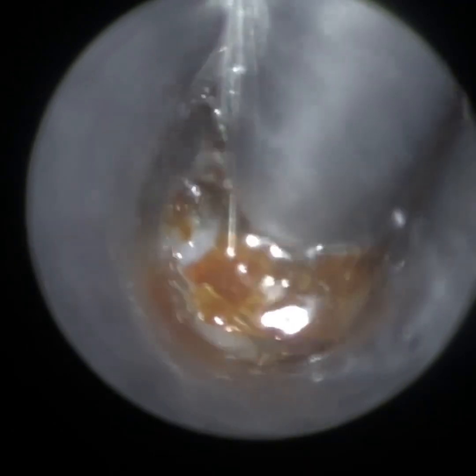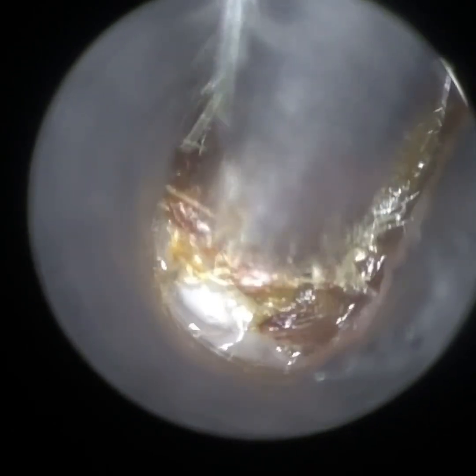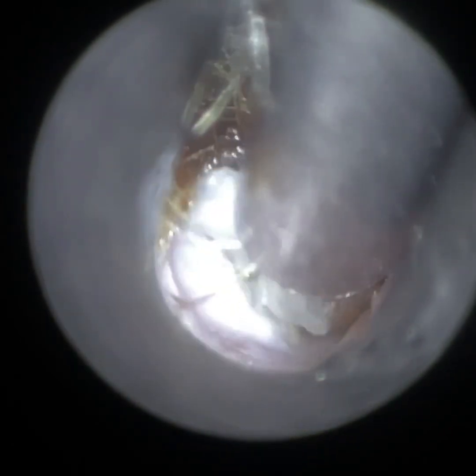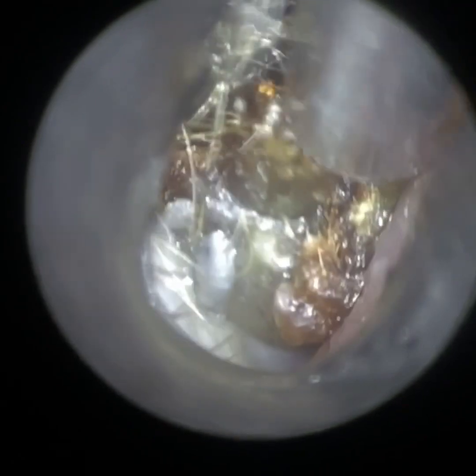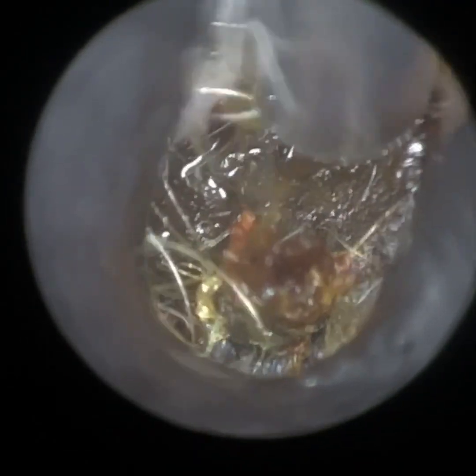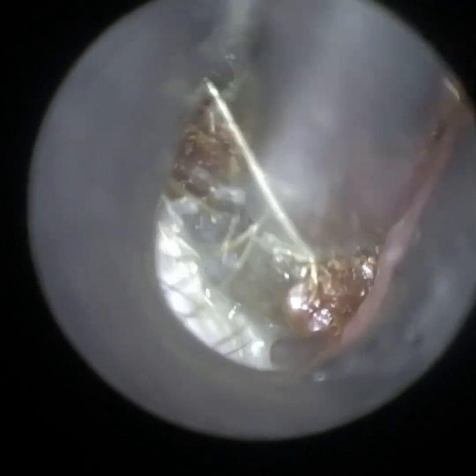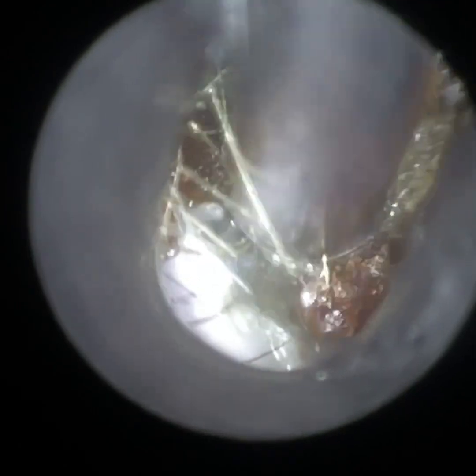The patient attended having been suffering for quite a while. You can tell by the colour of this wax and skin — there's loads of skin adhesions, and they have got an otitis externa as well, superficial. There's a slight bit of edema, and that could just be because the wax is really impacted and that's causing the edema. I've recommended after the procedure the patient needs some Ear Calm. Once I removed this really impacted wax, you can see how impacted it is, and you've got these thick skin adhesions at the base of the ear canal that attach to the canal wall and also the wax and keratin plug.